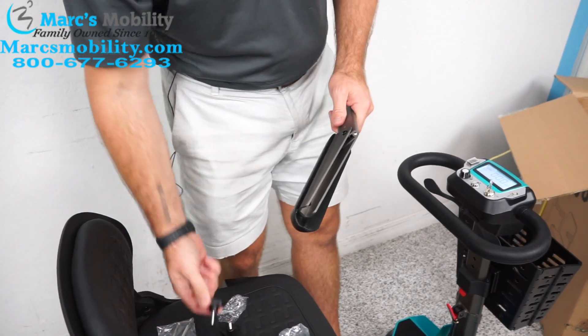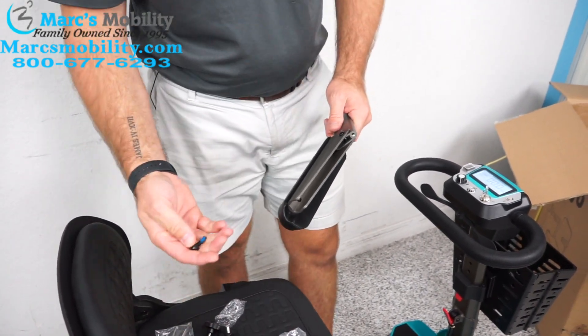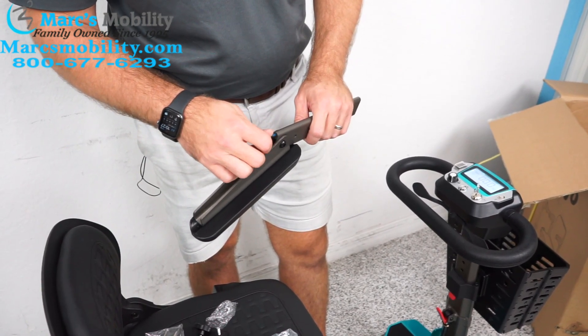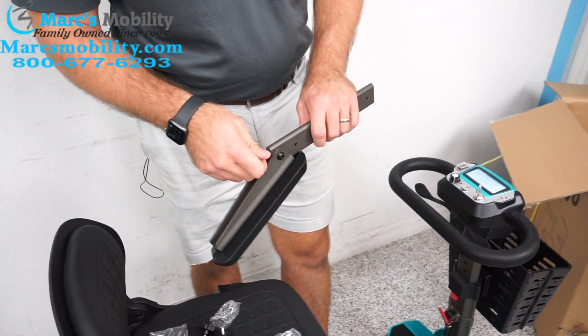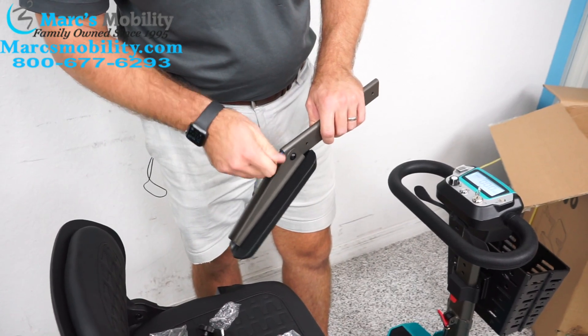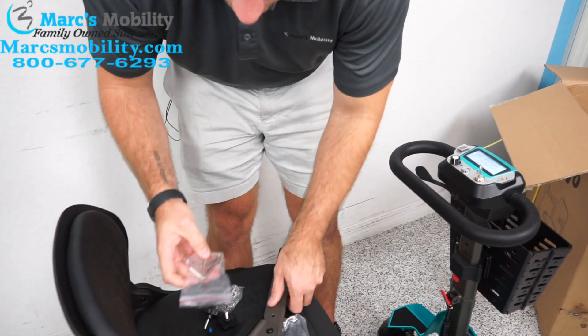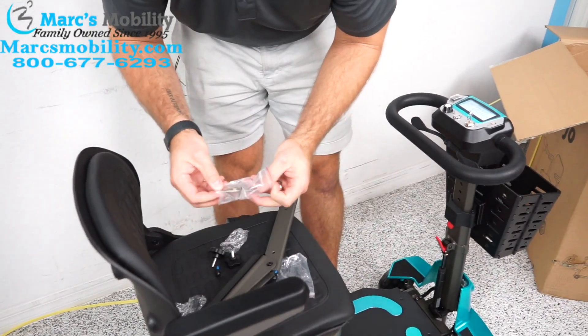Inside your bag, you're going to have two large thumb screws, and also smaller ones with an Allen key. You're going to screw that screw into the threaded hole. Sometimes you can twist it in by hand; otherwise they do provide you the Allen key in the bag to tighten it.